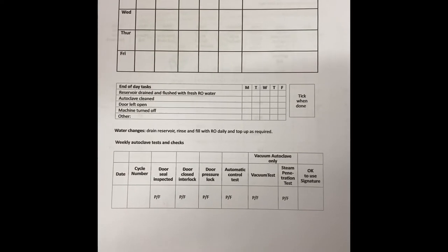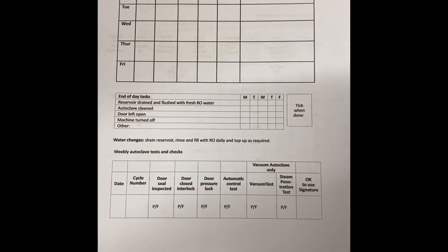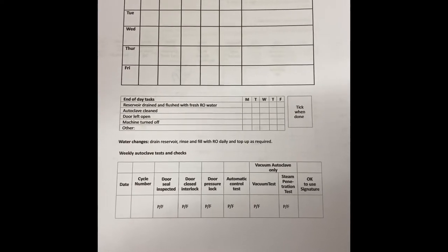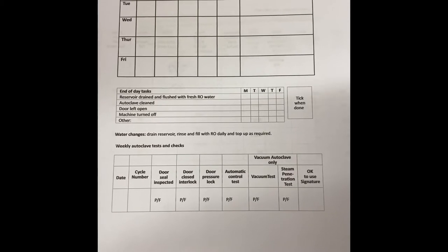On the reverse of the sheet, you'll see something called a steam penetration test. The steam penetration test needs to be done once daily, and that's basically using a little device which checks to make sure the vacuum part of the autoclave is functioning correctly.